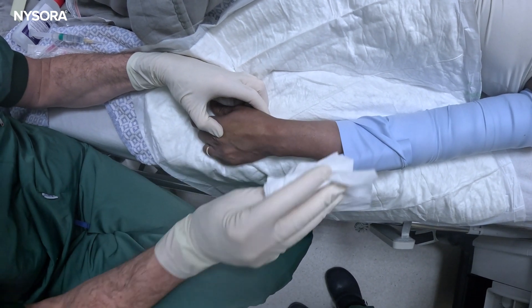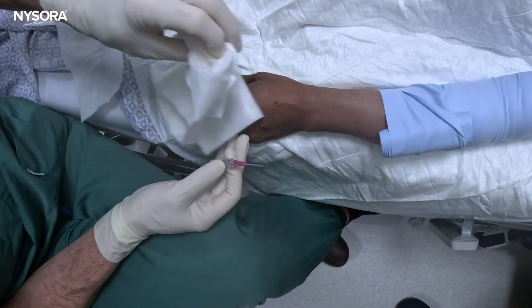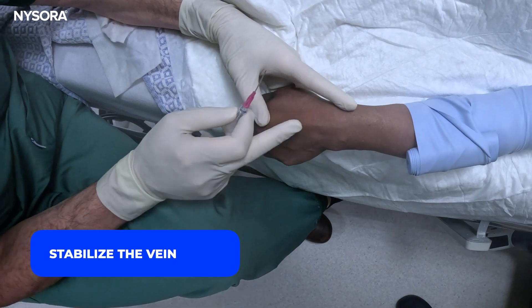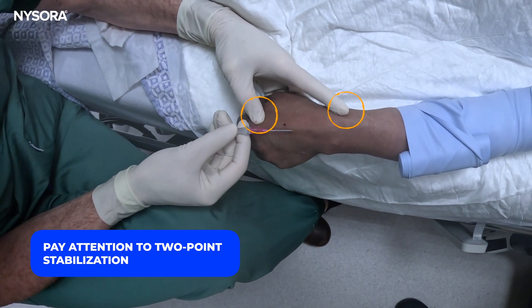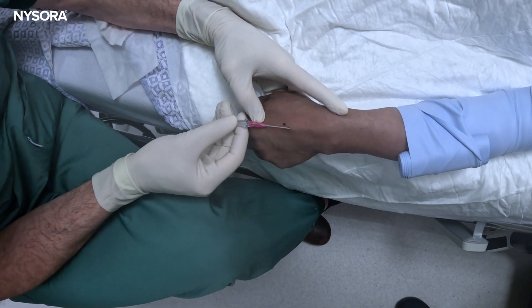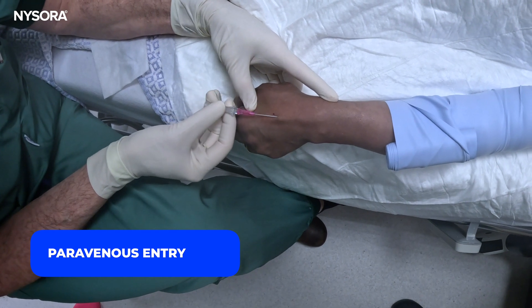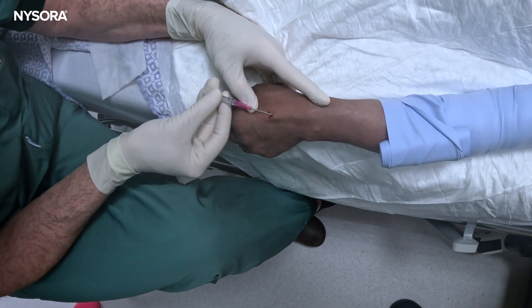It does not appear to be thrombosed but it has very thick walls. I'm going to do a little bend of the catheter. Let's see if this is successful — we'll tense the skin, stabilize it, and then go really quick. We're going to start on one side, not over the vein, so we have a little bit of the catheter and needle inside before we slightly re-angulate to insert the catheter inside the vein.